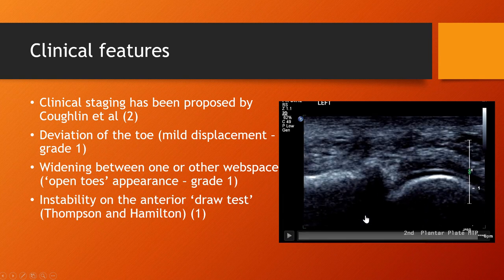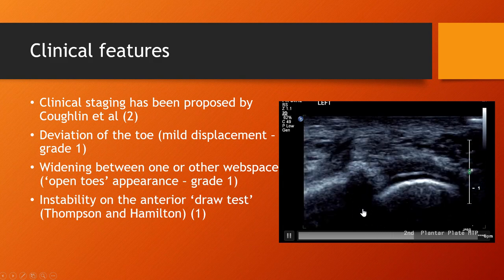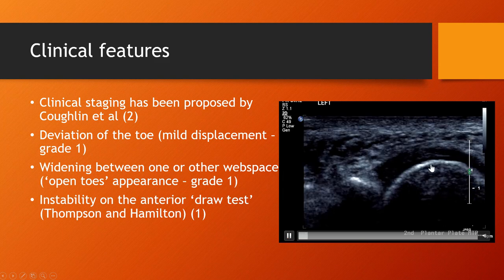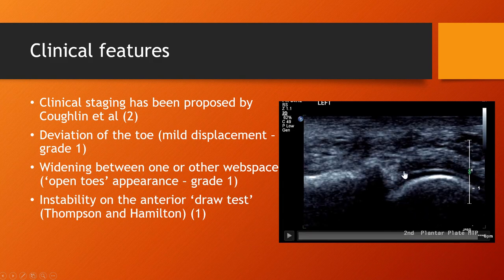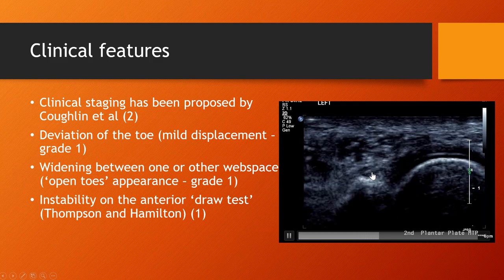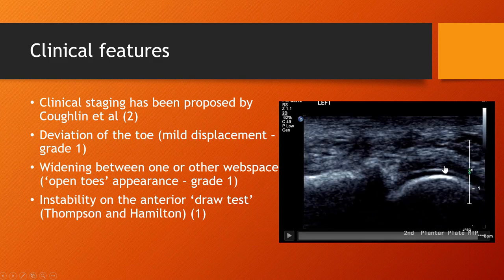So this is how we should examine the plantar plates, because when we sublux the proximal phalanx dorsally, when we draw it dorsally, the plantar plate tightens. And so you see as the proximal phalanx drags, it drags the plantar plate with it. So when it's completely disrupted, this joint can look very floppy and hypermobile, and we won't see the plantar plate pulling with it.